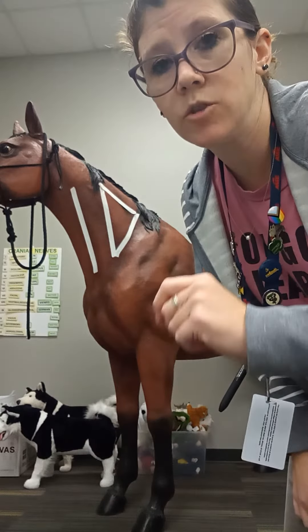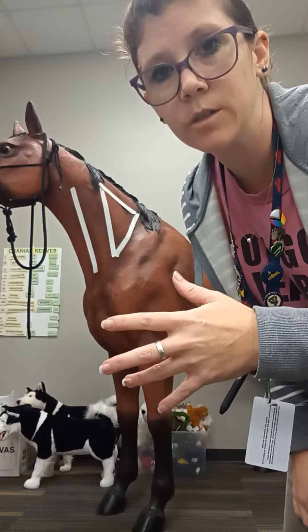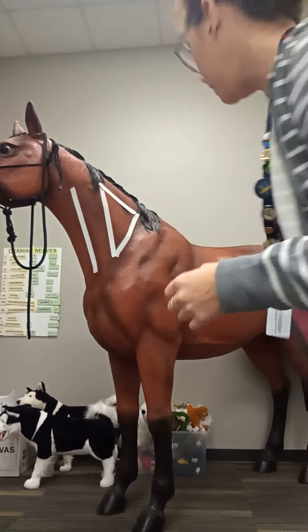This video is going to cover horse injections — intramuscular injections in the horse, in this triangle neck area.